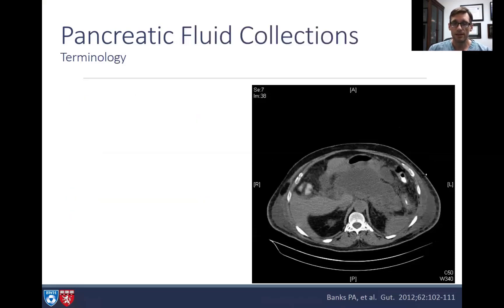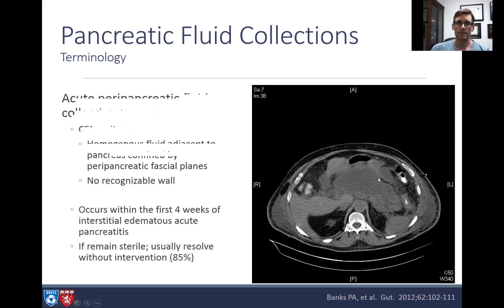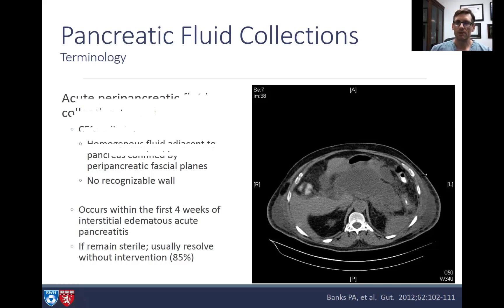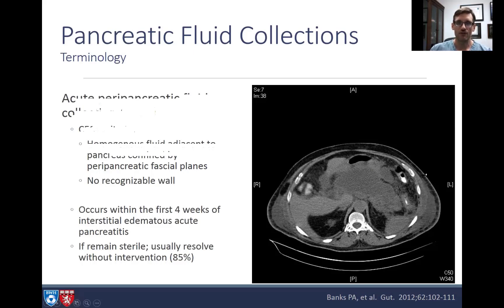Perfusion is preserved, and 85% of acute pancreatitis cases present like this. Next we have an acute peripancreatic fluid collection — homogenous fluid adjacent to the pancreas, confined by peripancreatic fascial planes, no recognizable wall. This typically occurs within the first four weeks of interstitial edematous acute pancreatitis. If it remains sterile, most of these will resolve without intervention.